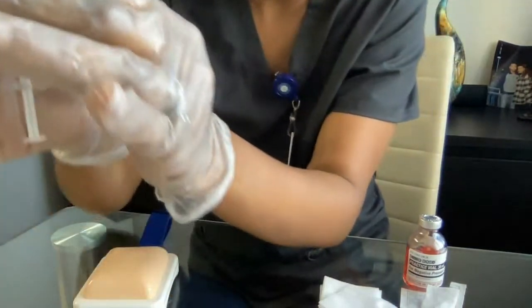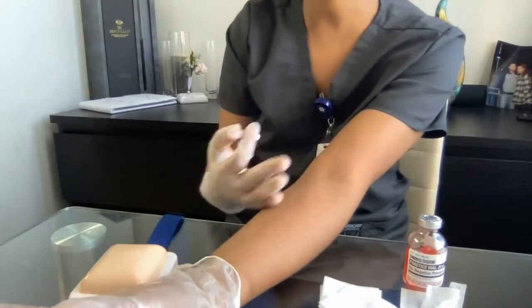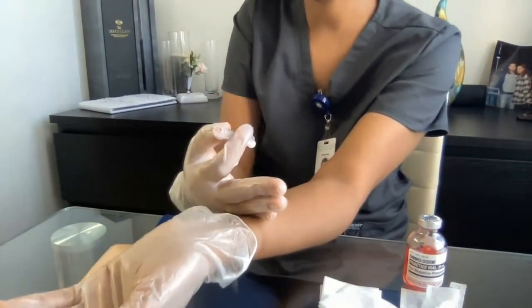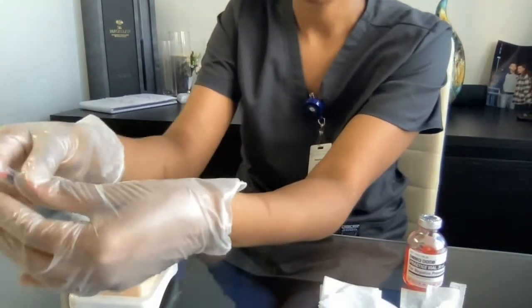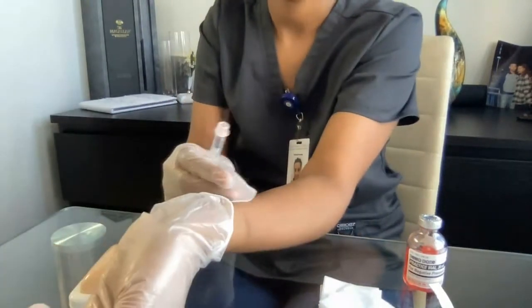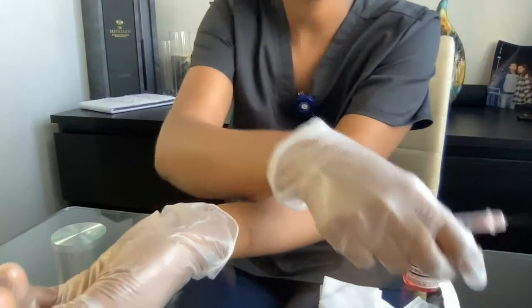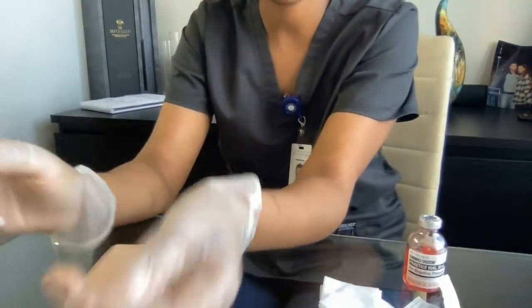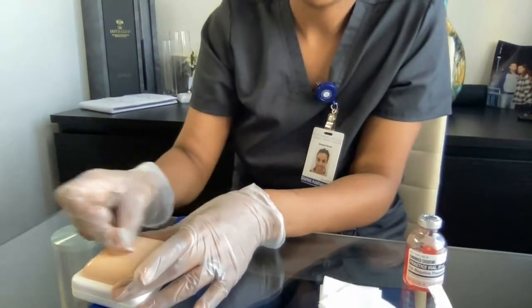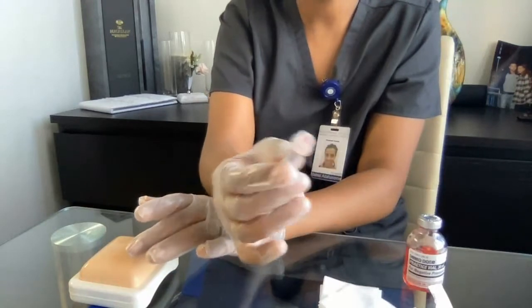I'm going to go to the site below the antecubital space, using the wrist to measure the location. I'll clean the area with an alcohol swab before my injection, let it air dry, and then hold the syringe with my thumb and forefinger on my dominant hand.